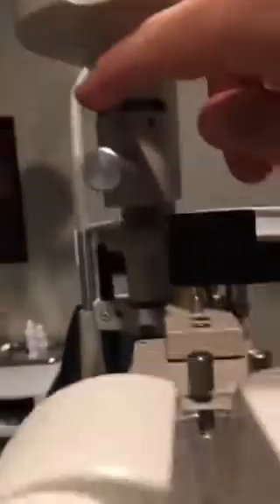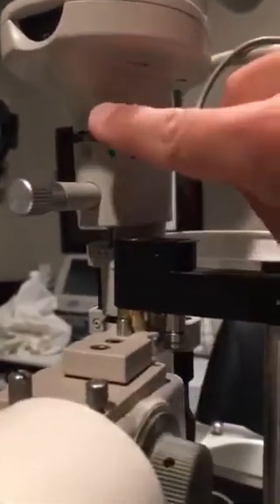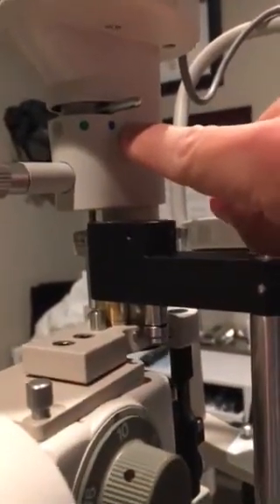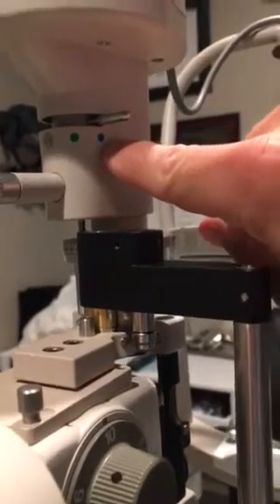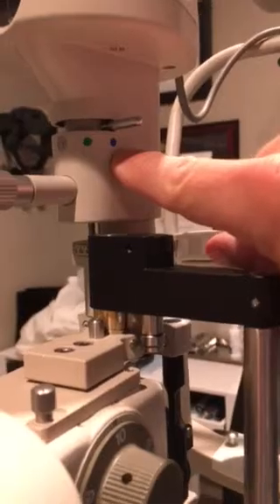We have UV filtered light, a red-free filter — a green dot — or a cobalt blue filter. The cobalt blue is going to be, in our particular situation, best used with sodium fluorescein staining. You'll use this a lot. The other one that you'll use primarily is going to be the full-on or the filtered. So you can change the light that's going into it.